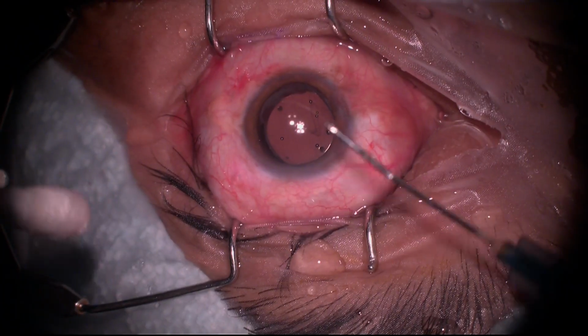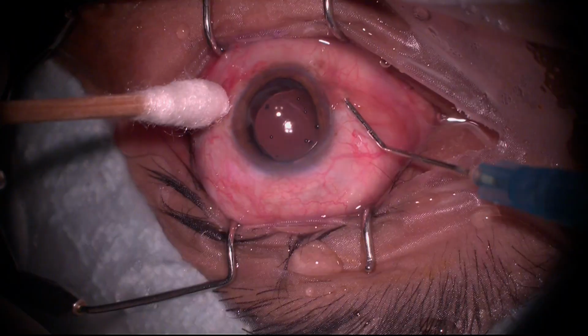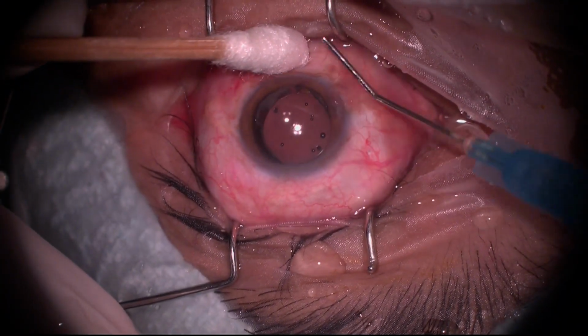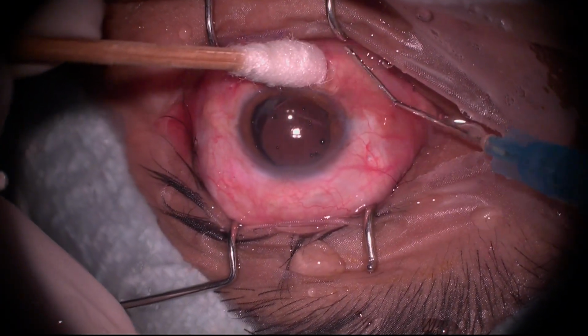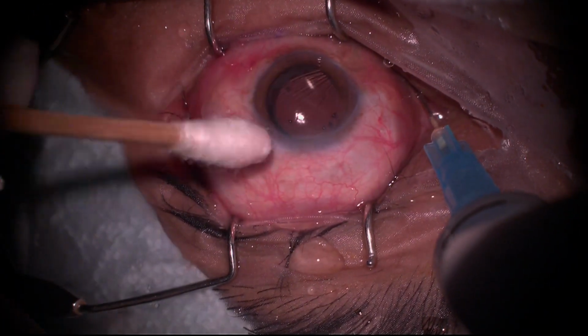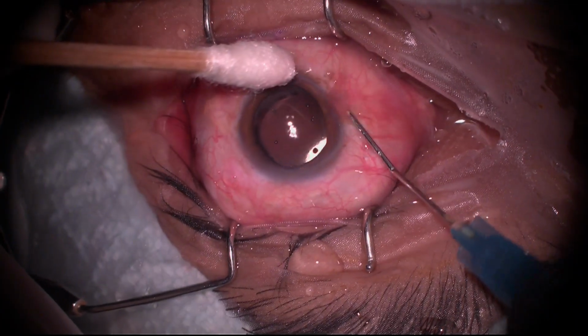एक रिंगर दीजिए. I think there's an adhesion here. You see this? See this?